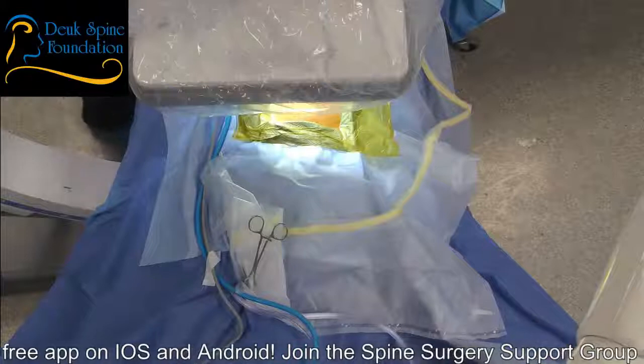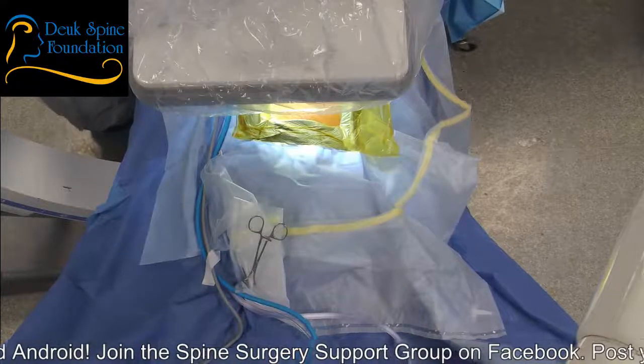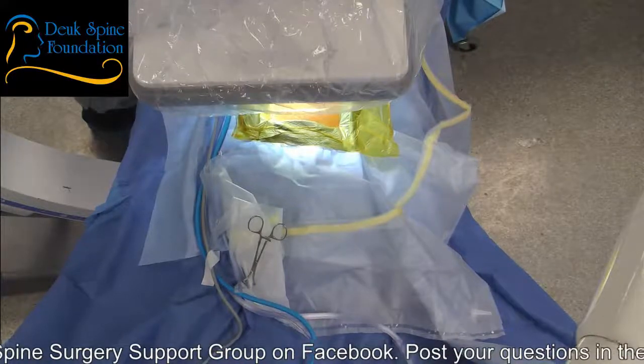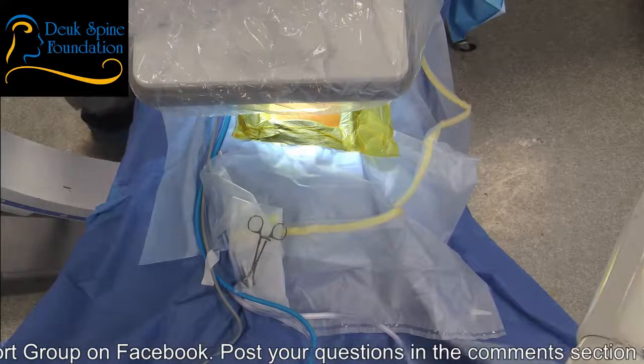Here for a Deuk Laser Disc Repair. Our patient has a herniated disc at L5-S1. He's got back pain and left leg pain, among other radicular symptoms down the left leg. Radicular symptoms are symptoms like numbness, tingling, weakness in the leg or arm.